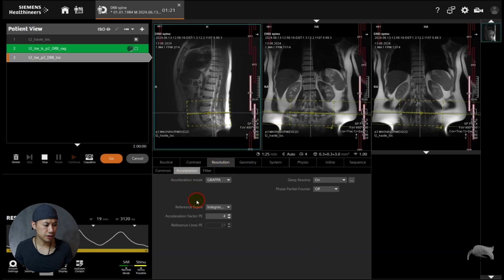If we go into resolution and acceleration, there is a setting called reference scans. If we open here, we can see there are two options: integrated or TSC separate. This can be confusing because sometimes one works great for a particular anatomy and weighting, and sometimes it doesn't work at all. You need to know what you're doing — whether you're at the hip or at the knee, you need to know which reference scan mode to combine with which sequence. So let's test both of these for the transversal spine, with exactly the same parameter settings.